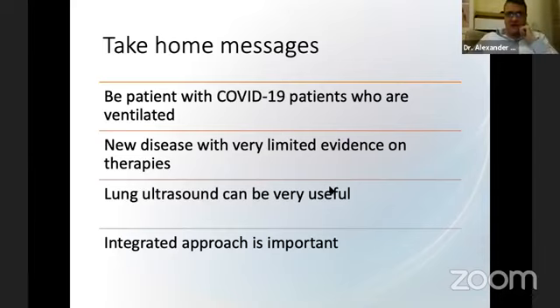Can I just give a comment here? With lung ultrasound, things are completely different compared to CT scans and to normal echo. The worse is your machine, the older is your machine, the less artifact suppression algorithms it has. And you see the B-line is much better.